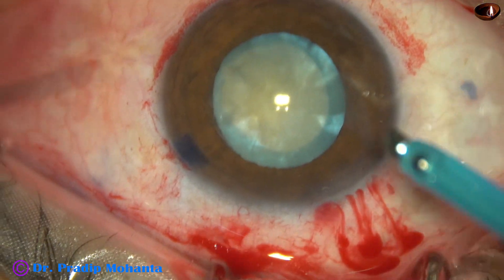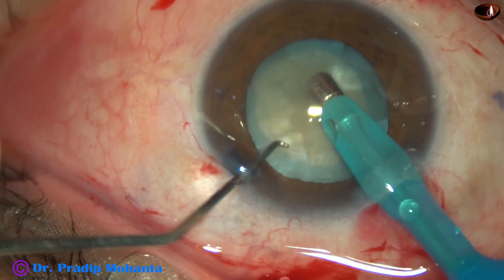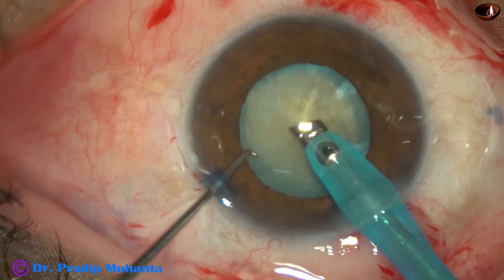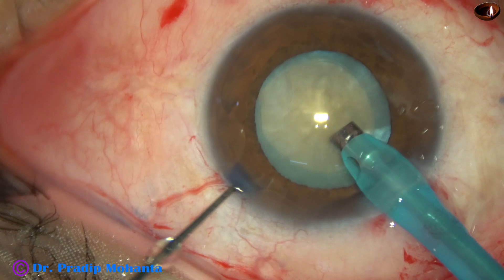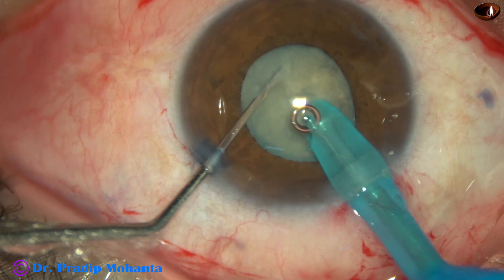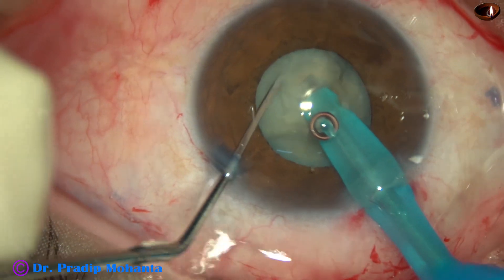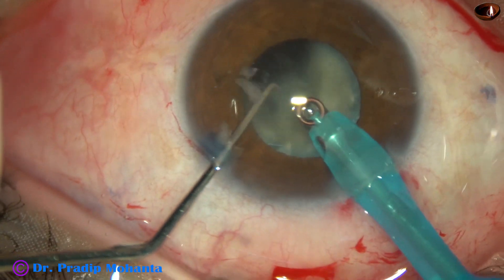And now nucleus management. My plan is to divide the nucleus into some fragments by direct chop. So I bury the tip into the substance of the nucleus and chop it. The nucleus is not hard. It is brittle and it is getting chopped easily.